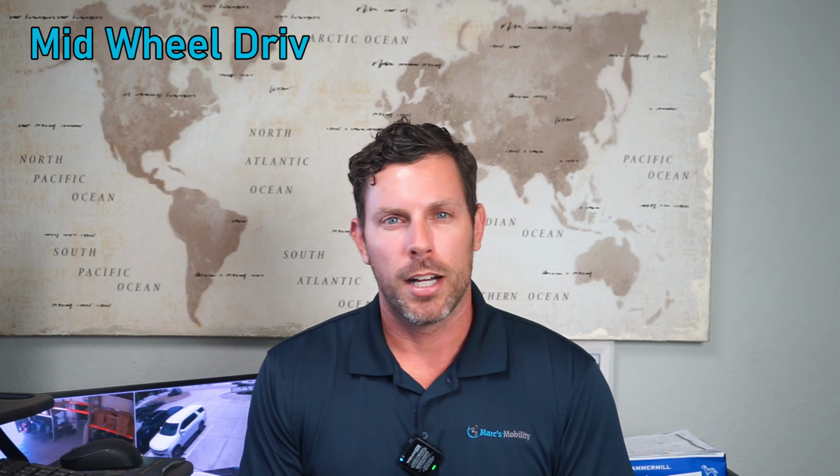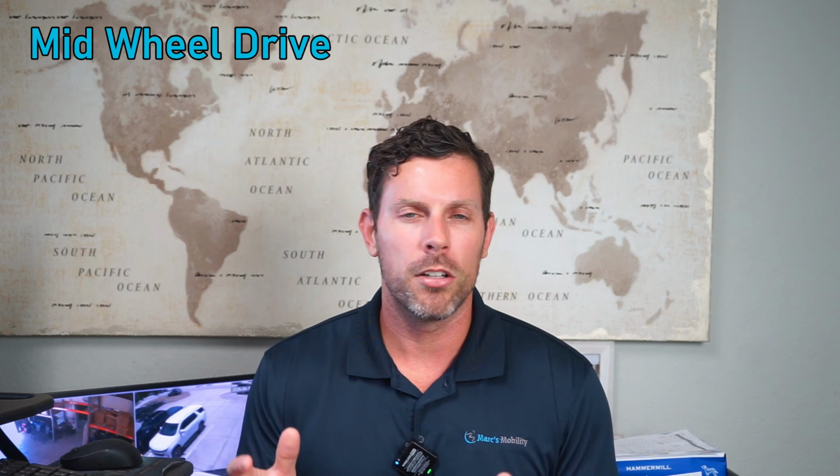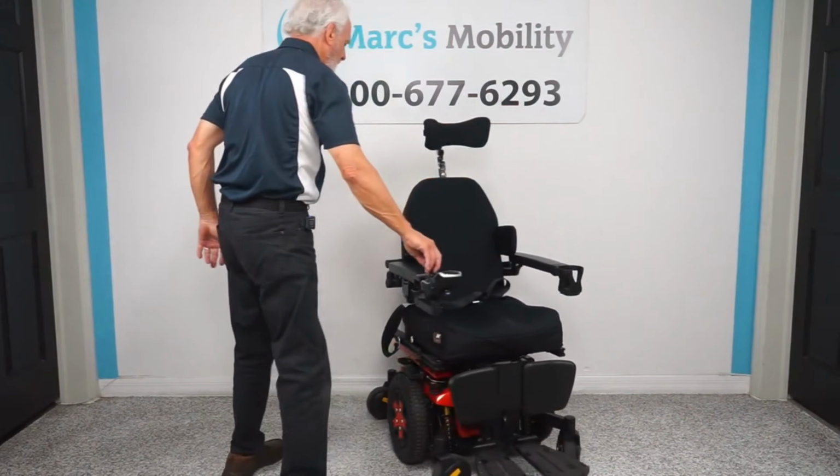Now there's going to be four major drive configurations from the Quantum Rehab products. You're going to have a mid-wheel drive, a front-wheel drive, a rear-wheel drive, and an all-wheel drive. Now I'm going to go over what the differences are with these units. The first one we're going to go over is mid-wheel drive, and mid-wheel is going to be a unit that is going to turn in the smallest turning radius due to the drive configuration.